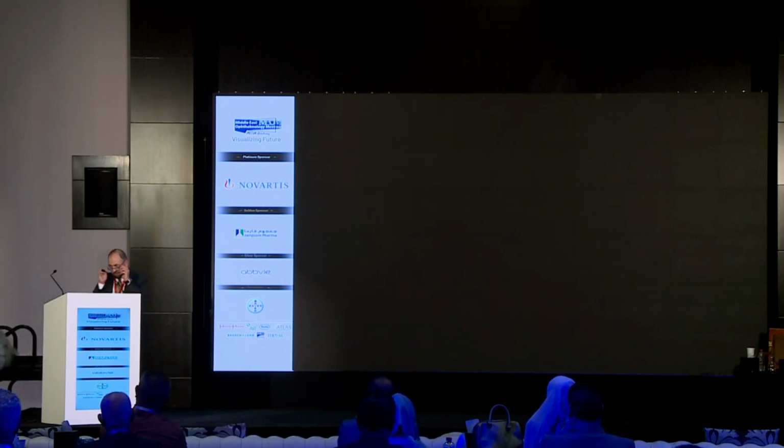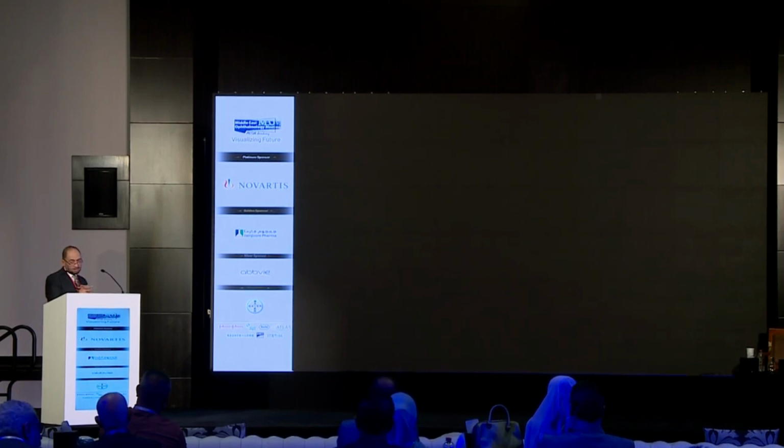So that hard time started from the capsulotomy, and all know, and Dr. Salah and Dr. Ashraf, that from the capsulotomy our story will start, especially in brown cataract or cataract nigra.